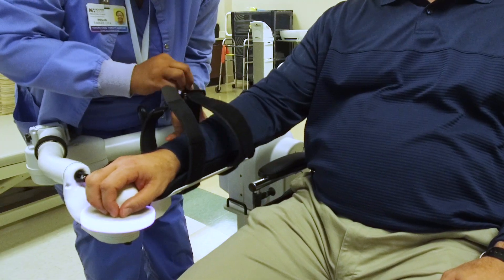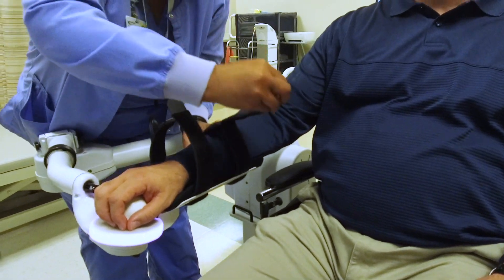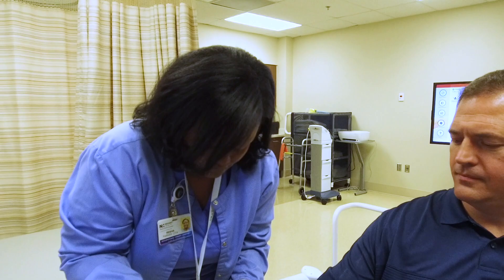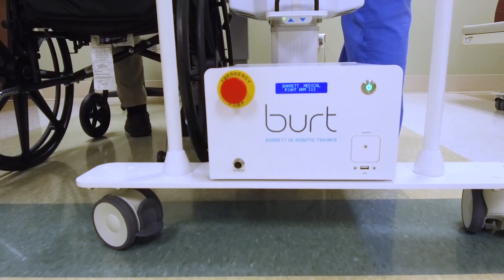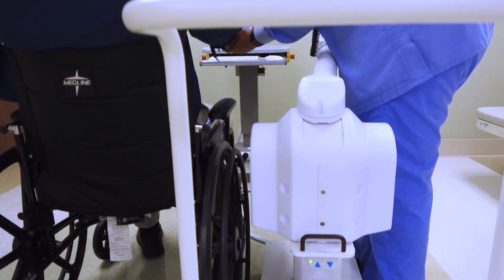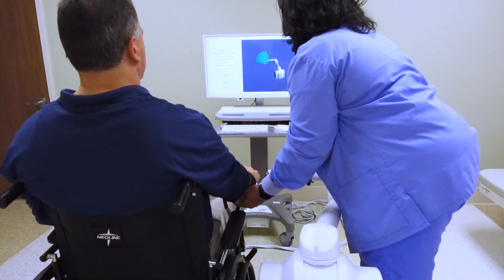The BERT, the Barrett Upper Extremity Robotic Device, is used for retraining the brain after a stroke or a neurological injury. It can work on strengthening the shoulder, it can work on reaching forward, and it can translate into more functional tasks — so somebody who needs to reach up into their kitchen cabinet, it can work to progress people towards that.